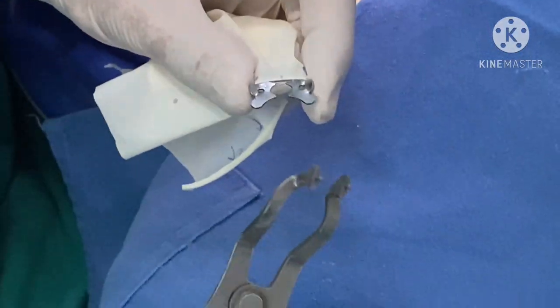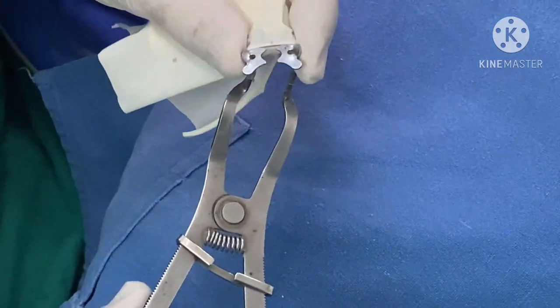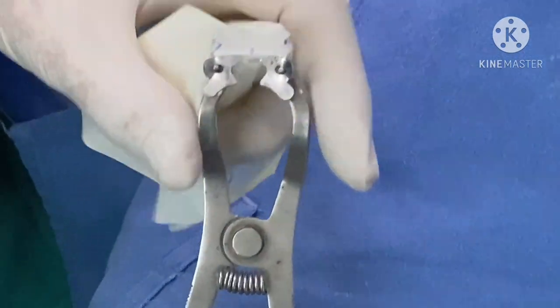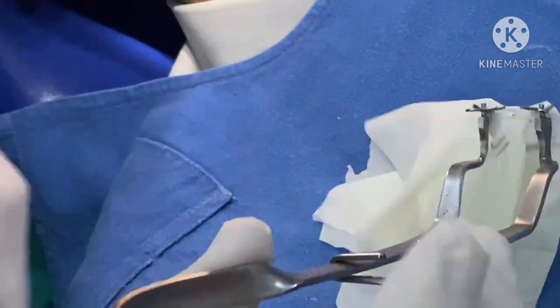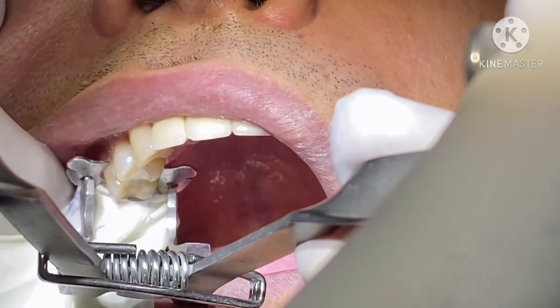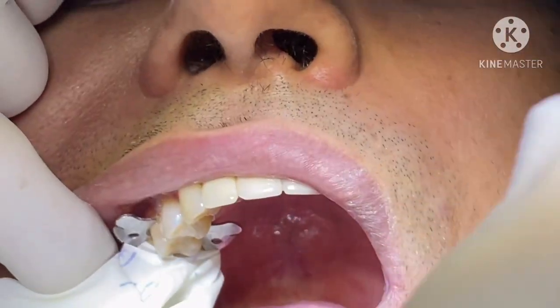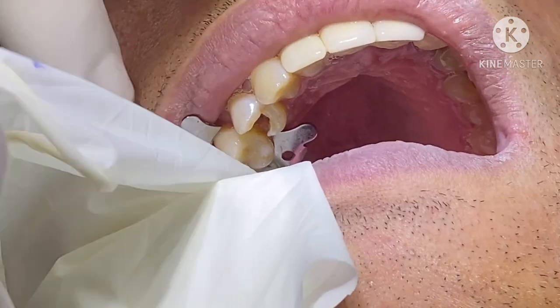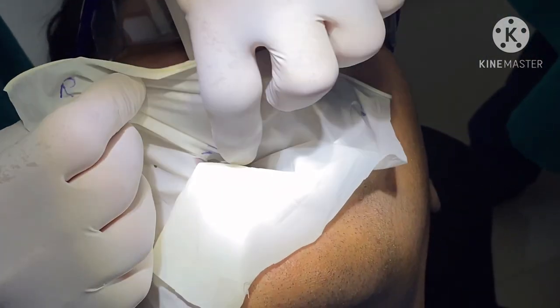Now we take the rubber dam clamp and put the prongs into the eyes. Stretch it a little and it's ready to be taken into the mouth. And after putting it, we release the clamp from here. We reverse it so that the right side comes on the right side and the left on the left side.